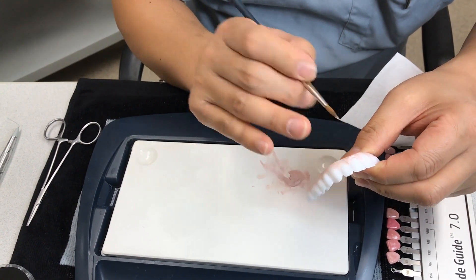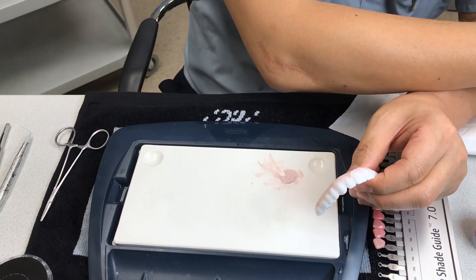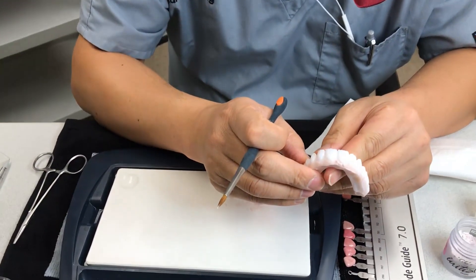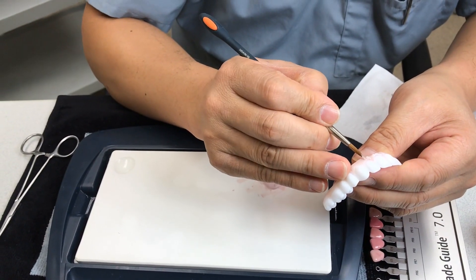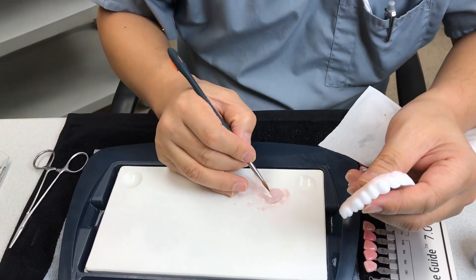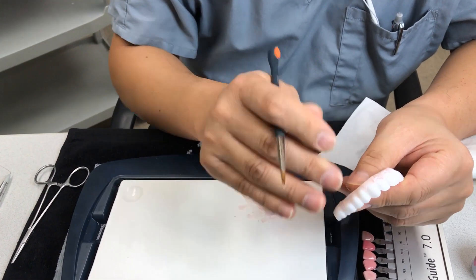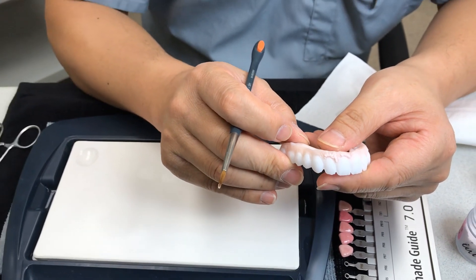So this is the first step to make the full arch restoration. If I want to go to this color — I call it gum two — so this is my aesthetic. Engage together with a brush and concentrate the margin area irregularly, just add it like that. Then I can fire it and get those colors.